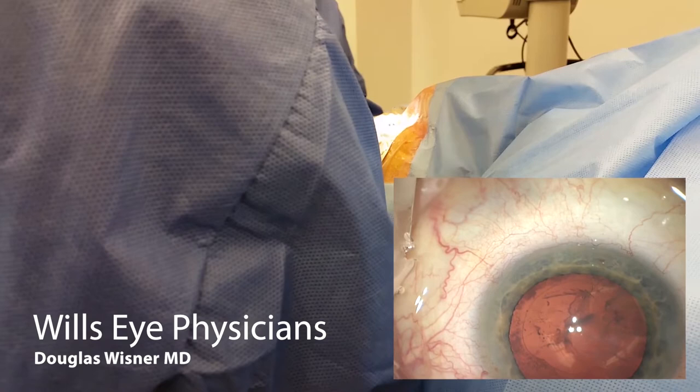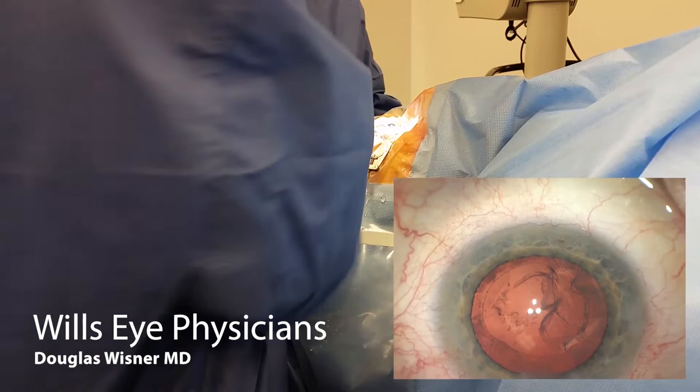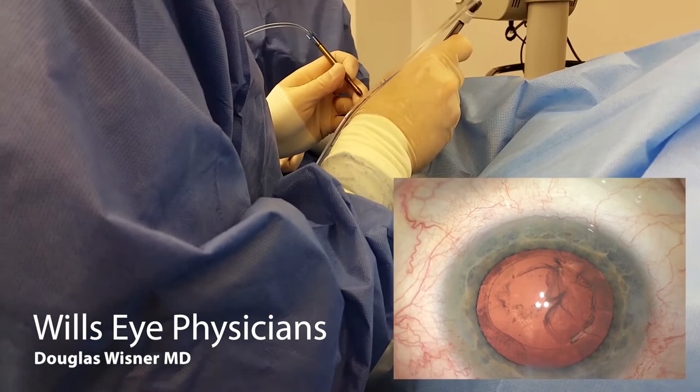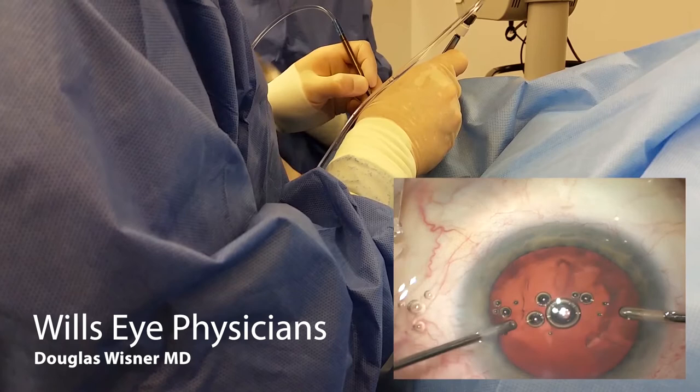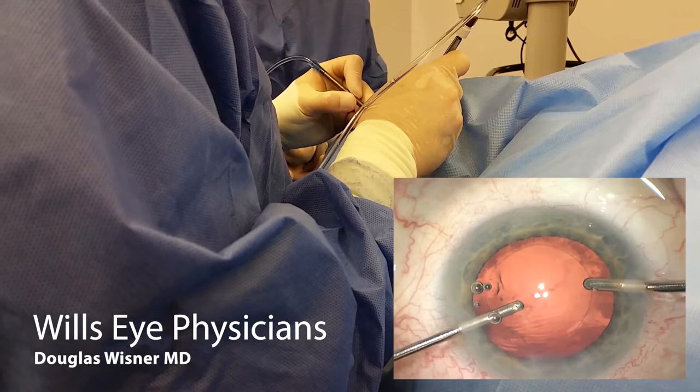Here I am forming up the globe a little bit more to get some more resistance, and then I'm going to take the side port blade, shimmy back in, and enlarge the wound a little bit. That's a 22.5 paracentesis blade. I prefer to use a side port blade because it's a standard width related to the stab of a blade and gives better wound architecture. So now I can get in nicely and remove the rest of the cortical material rather than forcing my way in.